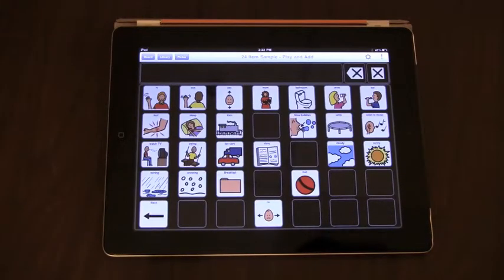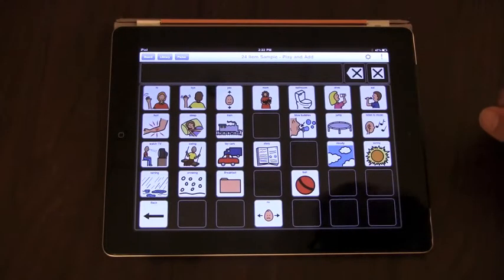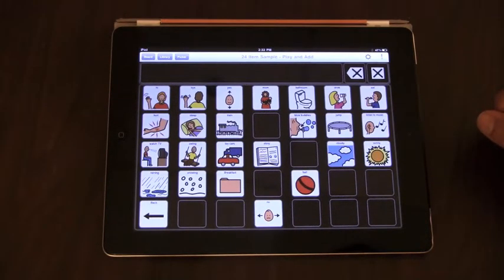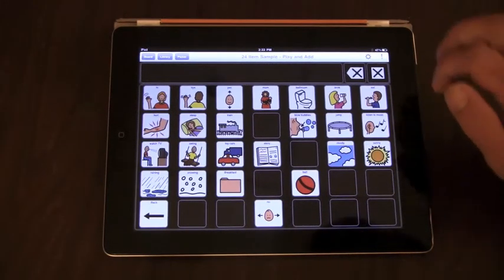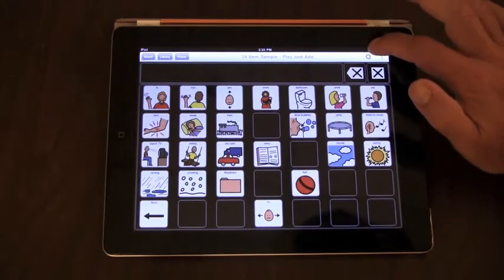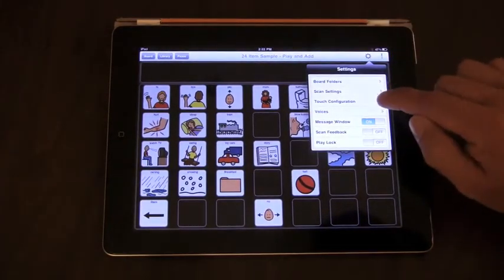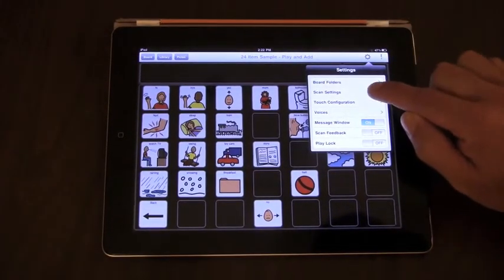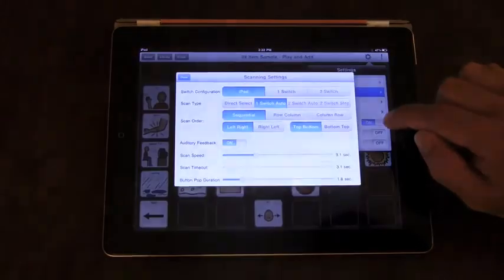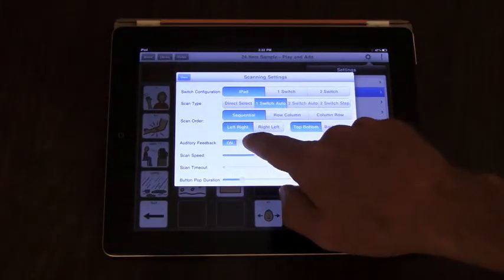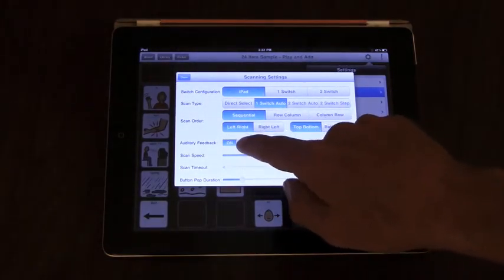So now let's talk a little bit about the auditory feedback options with TabSpeak Choice. In the scan settings, we have auditory feedback that can be turned on and off.